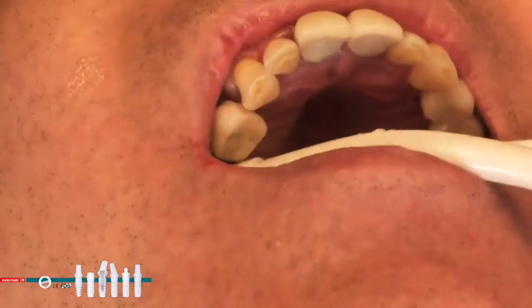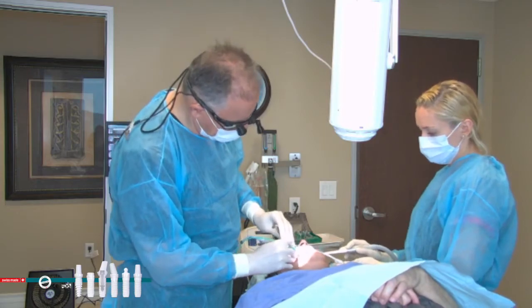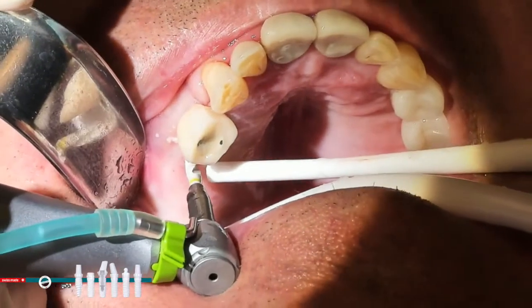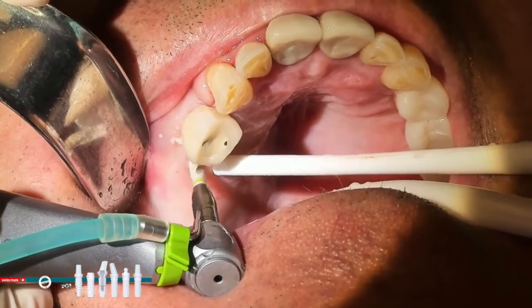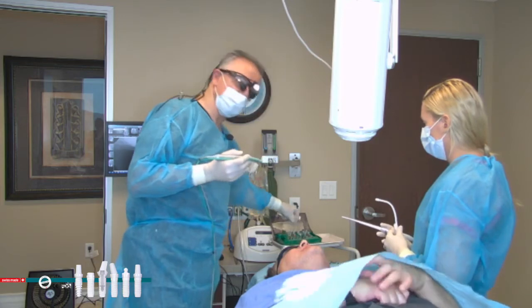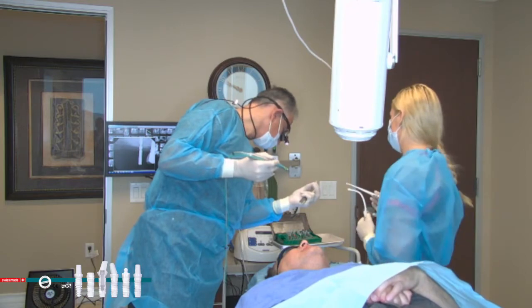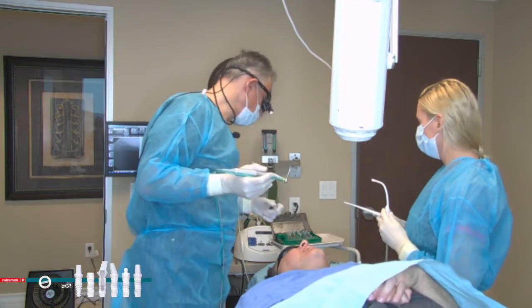Open wide. I put the drill extension because the drill couldn't get in all the way. So this is just a drill. Open your mouth, please, a little wider. And with this, you can get in a little bit deeper. So this is our second drill, which was a TD 285. Now we just go to our last drill, which is a TD 325. And then we do a countersink.